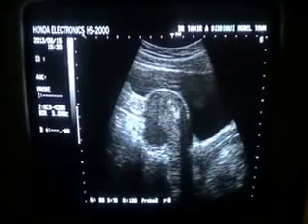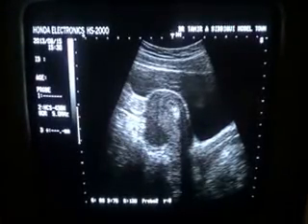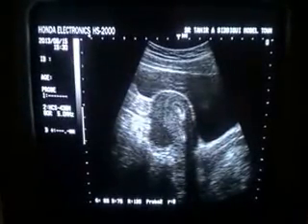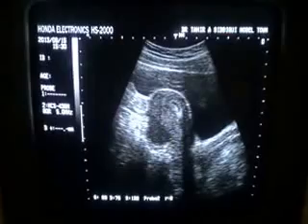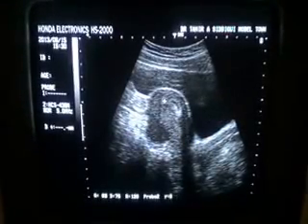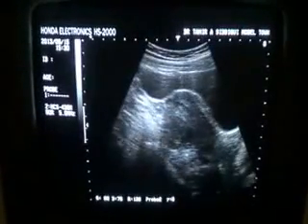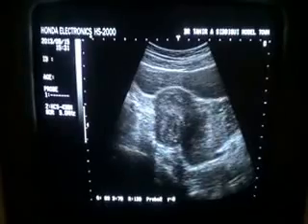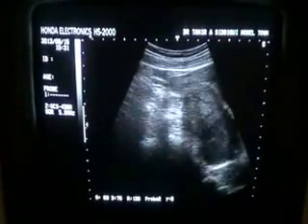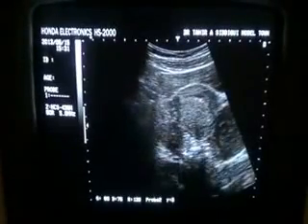This slit-like area that you are seeing in a longitudinal section of the uterus is the endometrial canal, and this is the anterior myometrium, the fundal region, the posterior wall, the cervix, the vagina, and this is the urinary bladder. This is the longitudinal section of the uterus. Now here below, posterior to it, what is this structure? It will confuse you at present.